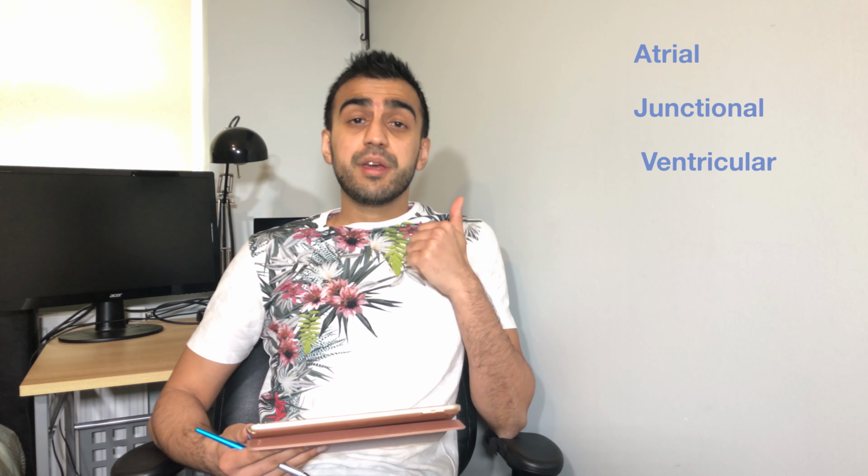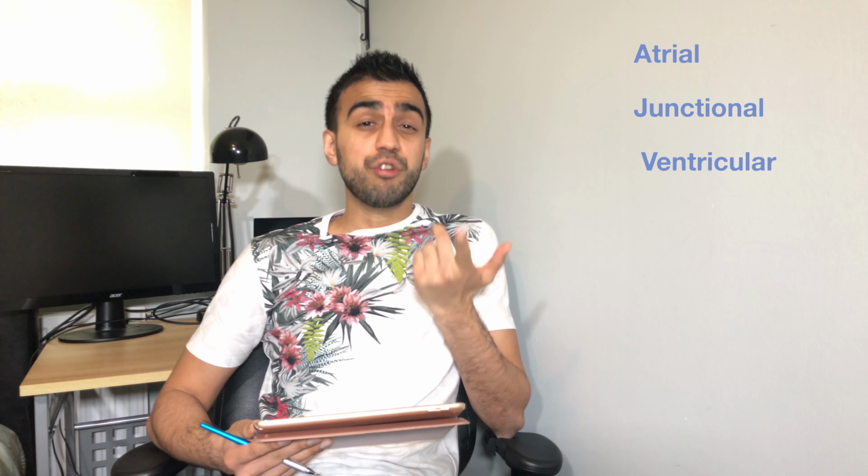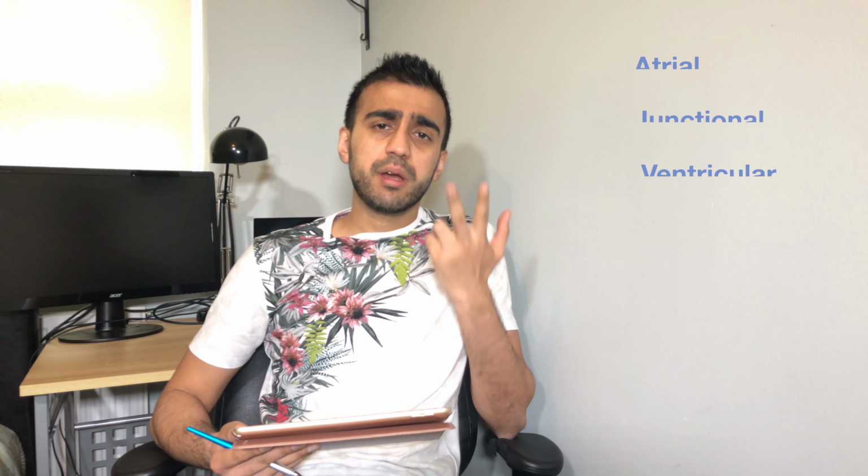So with the ECG, abnormal rhythms can occur at one of 3 places. It can either occur at the atria muscle, it can either occur around the AV node, so we refer to that as junctional area, or it can occur within the ventricles. And all of these problems can represent themselves differently.